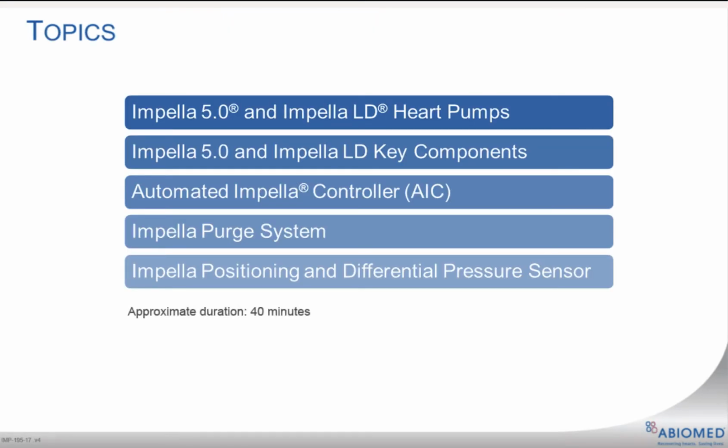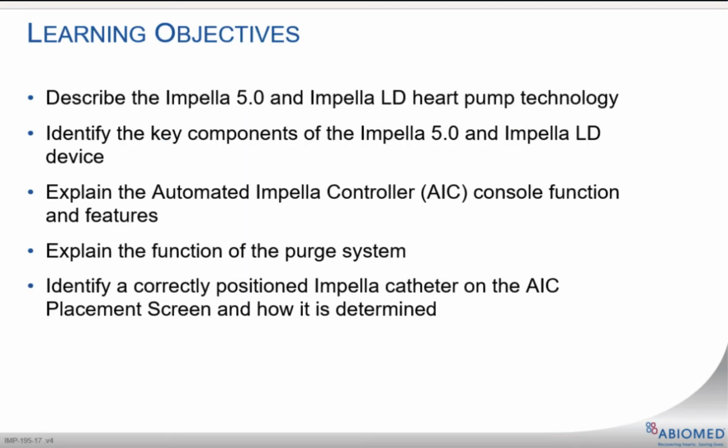This training will begin with an overview of the Impella 5.0 and Impella LD heart pump technology and system components. The automated Impella controller, which is the interface for monitoring and controlling the function of the Impella heart pumps and PURGE system, is introduced, as well as how the differential pressure sensor is used to monitor position and calculate flow. Take a moment to review the learning objectives. When done, click anywhere to continue.